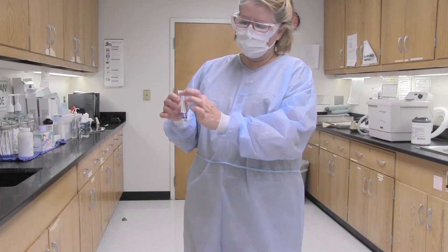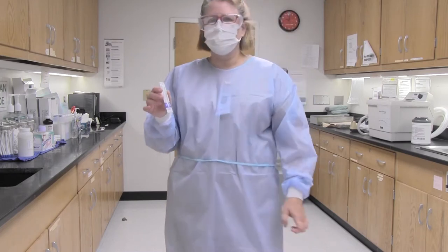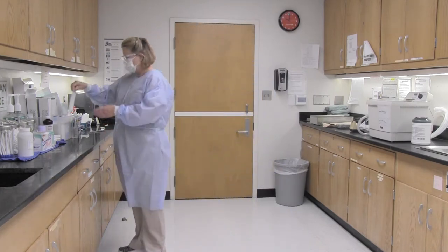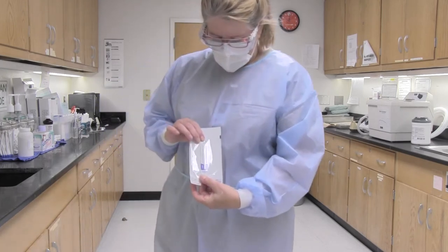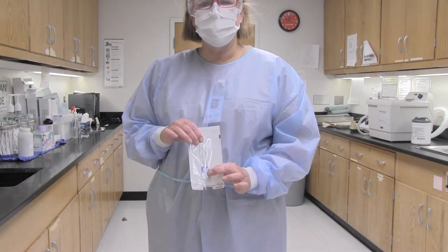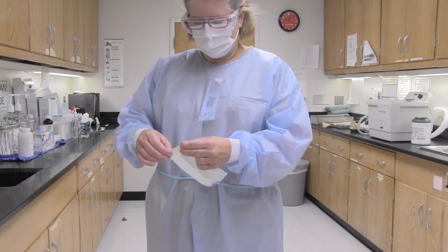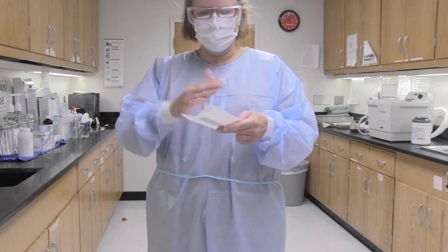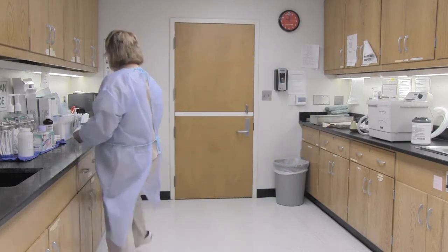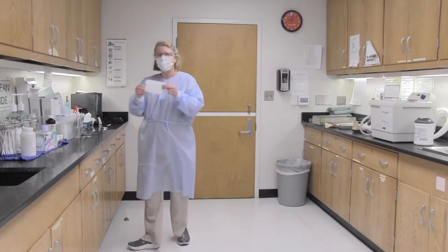Make sure you have the autoclave number — in this case we're using autoclave one, so that will be A1 — the date, and your initials. Take a bag and make sure that when you insert the integrator, the steam safe end goes in first. When you fold over, just fold over enough to close up the top. You don't want to fold it all the way down. On the outside of the bag, write the autoclave number, the date, and your initials.